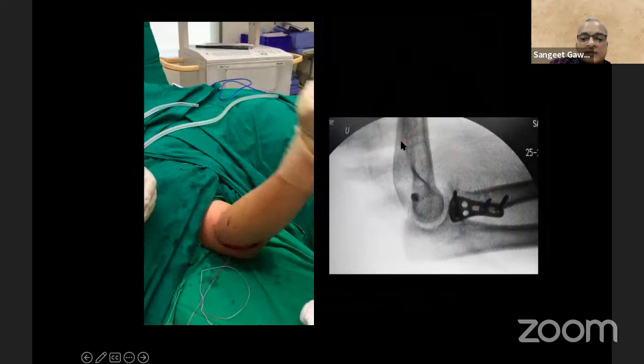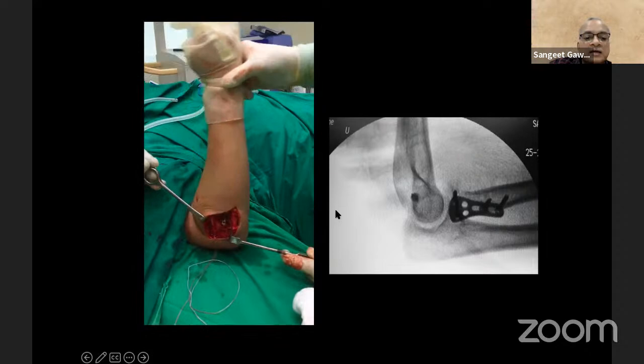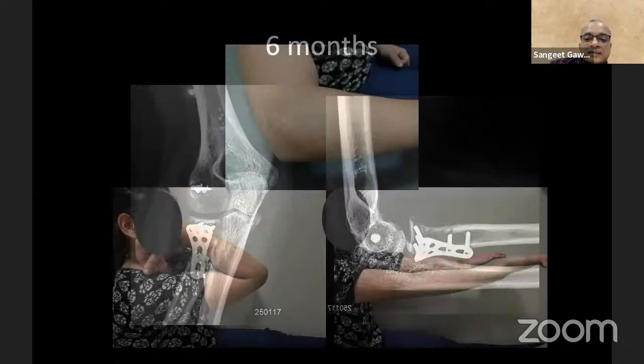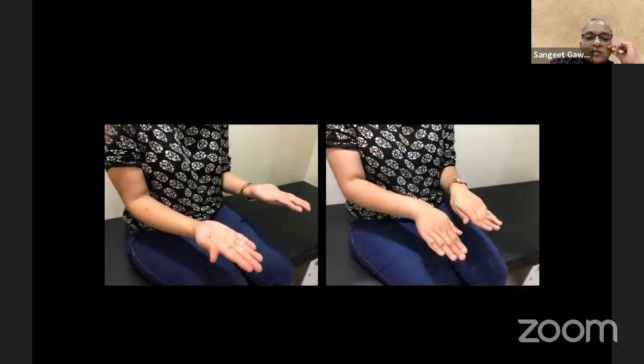And that is the range of movement on the table. This is a suture anchor for suturing the common extensor and the lateral ulnar collateral ligament, which is the cause of the elbow dislocation. And that is her x-ray at 6 months. And this is her x-ray and the range of movement at some time, I think 1 year or so.